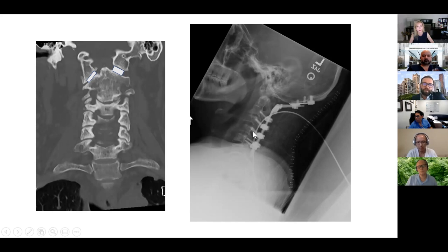If a patient has kyphosis to start with, meaning that his SVA is large, you want to stop down at the thoracic level, but I'll stop in the subaxial spine. Probably C4 would have been enough in this patient, or right here, that's C4, that's C3, would have been enough. But I just wanted to obtain multiple points of fixation and avoid failure as much as I can. Now, in terms of bone graft selection, BMP.